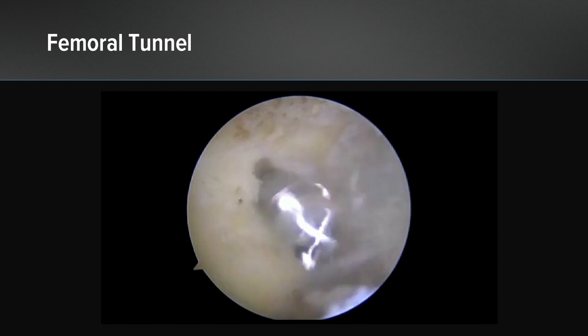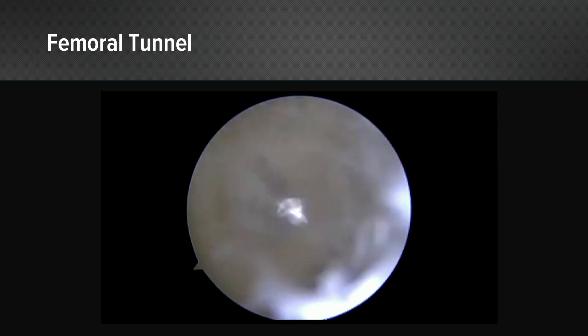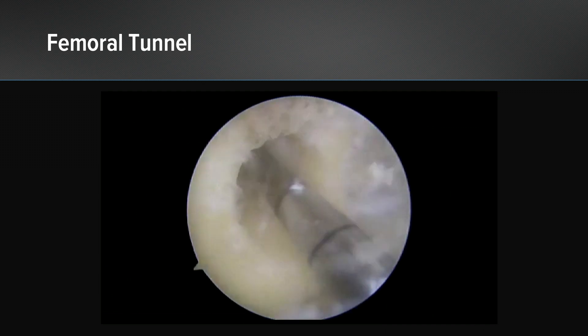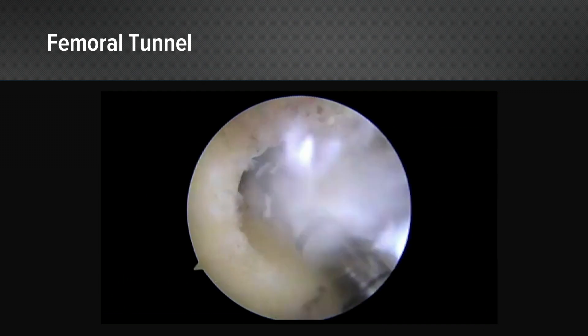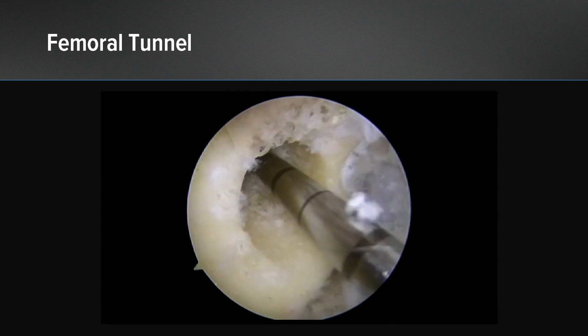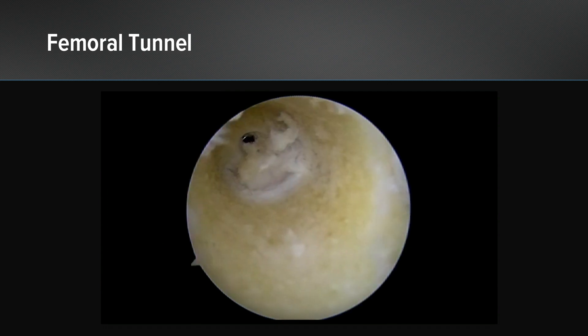The technique I like to use is to establish a small footprint right there, confirming I like what I see, and then drilling the entire tunnel up to the depths that have been previously calculated. Then click back down to the 3-5 and you can pull it out easily, followed with the fiber stick for passing your graft into your tunnel.